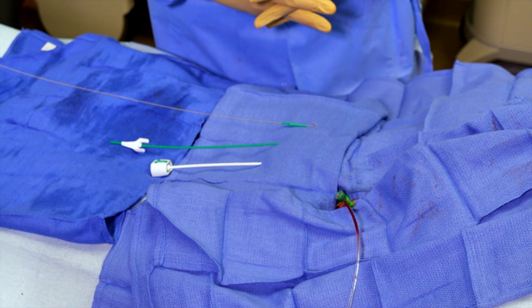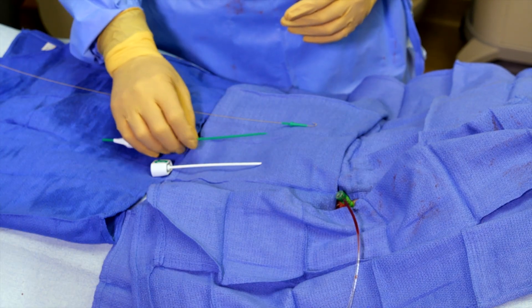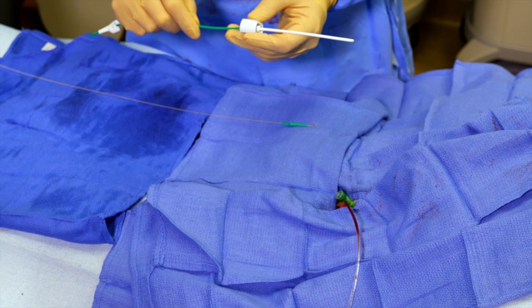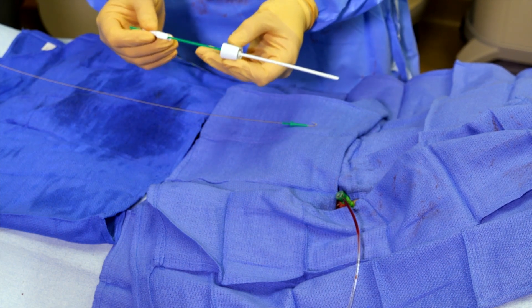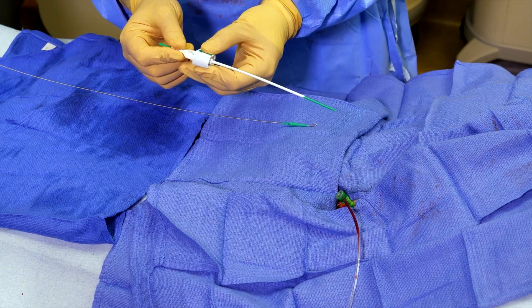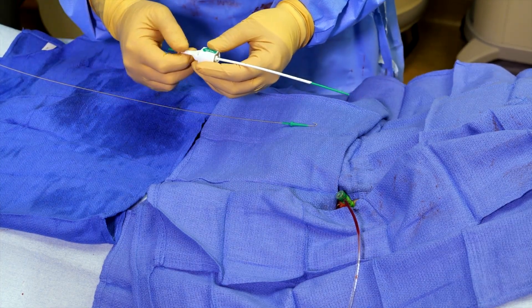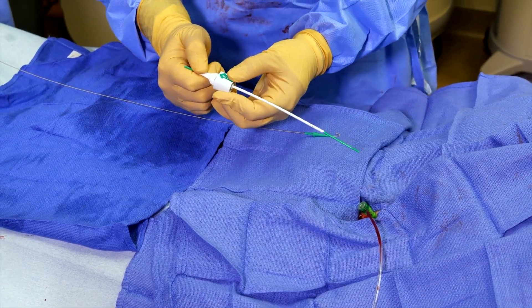We've finished with our case, and now we are going to place the closure device. This involves assembling the device — we have our sheath and our arteriotomy locator, which is this green tube. It slides through this, and when we reach the end, we want to hear a click, or at least feel the sense that there's a lock that takes place at the very last moment when these are connected.